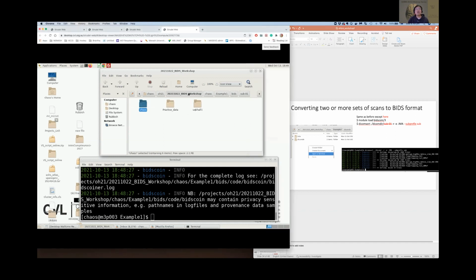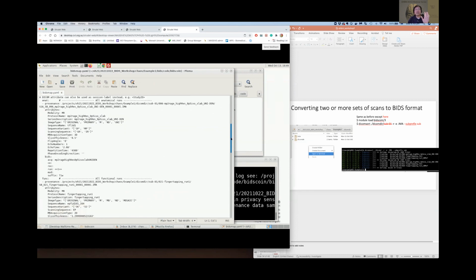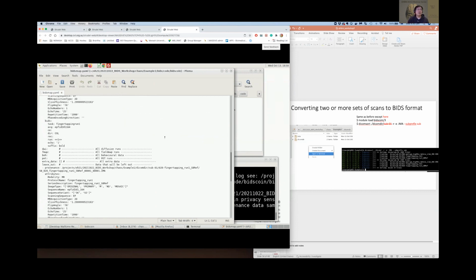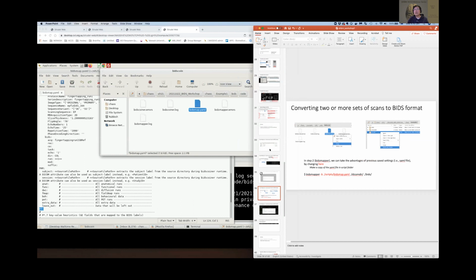But I do want to draw your attention over here. It's this one, in the code folder in BIDS, the YAML file that we talked about. Here is all of the information that you remember changing in the GUI. Everything is here, and you can even change it in here instead of using the GUI. Also, the last thing to note: it does accept PAR files, which are from Philips, and P7 files, which are from GE scanners. If you want to bring your own DICOM and try it, just do it in the hands-on session. Okay, so I think I'm pretty much done with this.